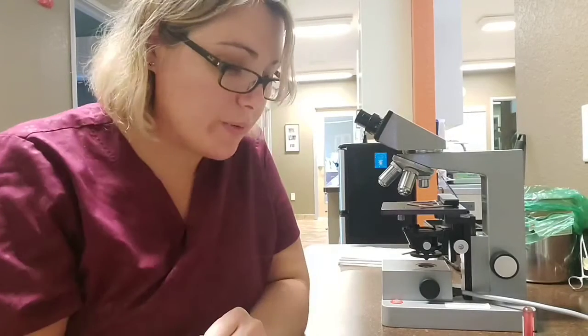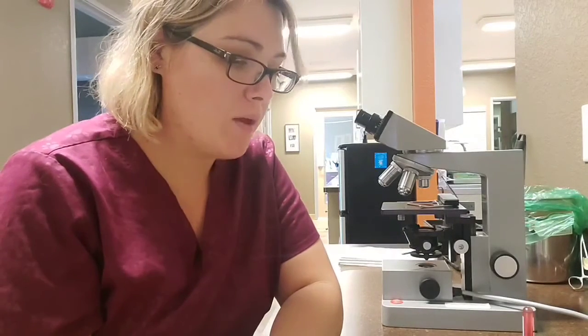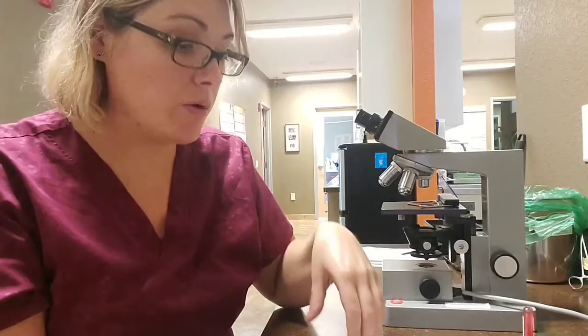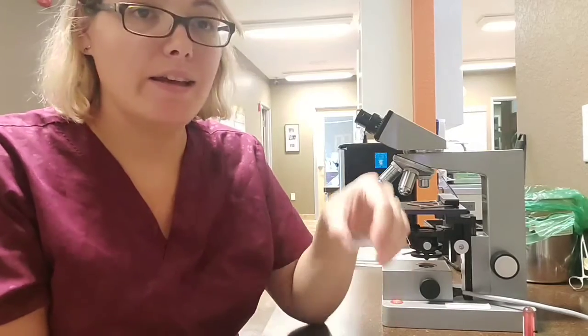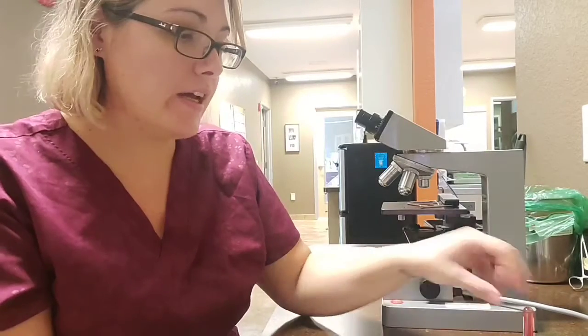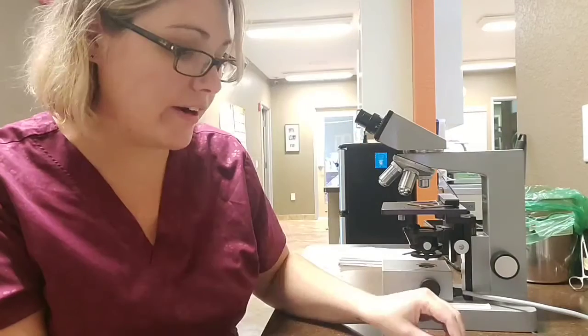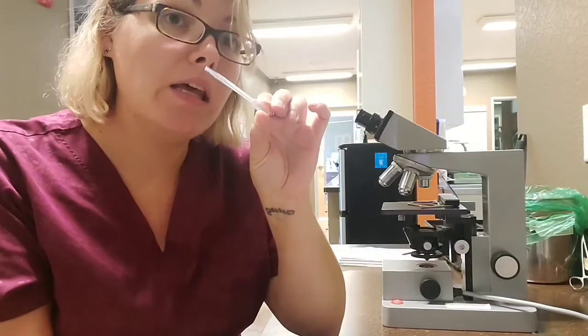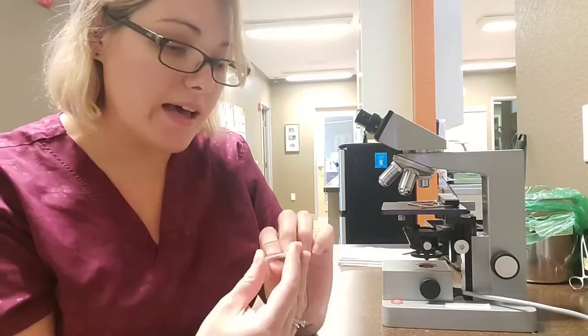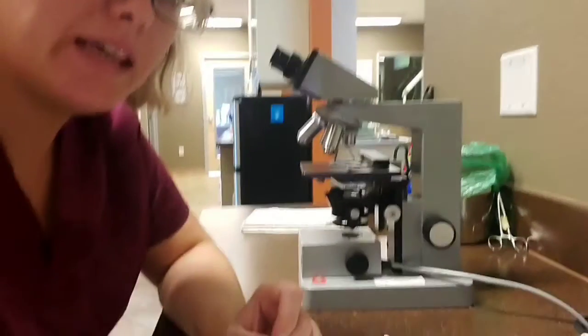All right, so I'm going to be walking you through how to perform a direct smear or direct drop heartworm test, where we're looking for microfilaria. So what we're going to need for that is a slide cover, a sample of EDTA blood here, as well as something to place our drop onto our slide. So I'm just going to kind of bring you down here with me.